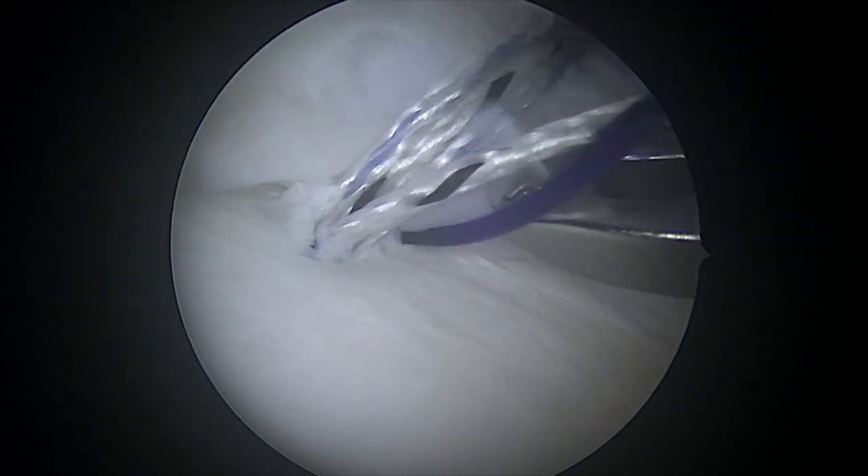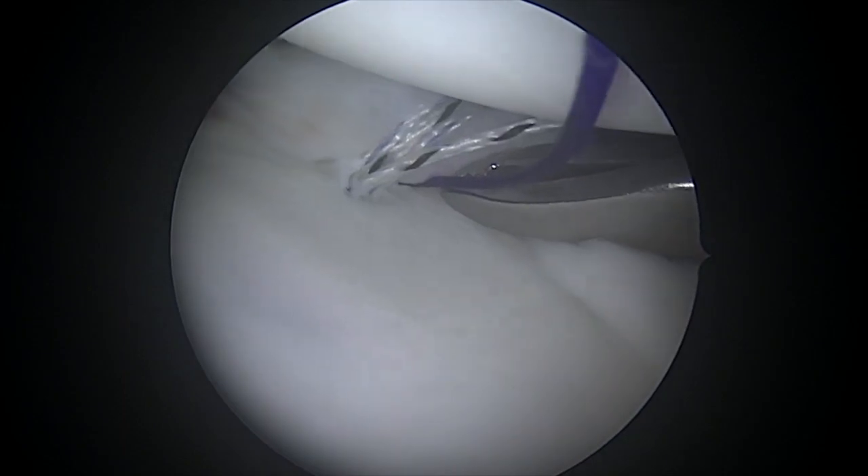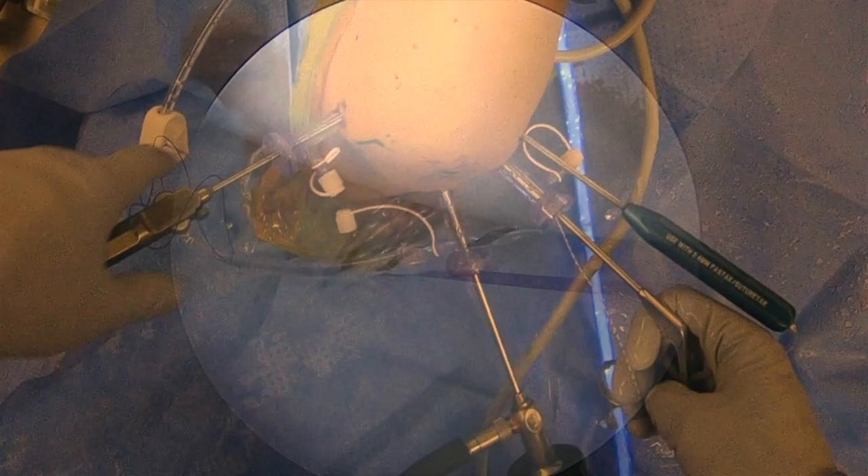I put anchors into the glenoid for this because I want to make sure it's really secure. Other people will just use the labrum as an anchor, and I have seen patients develop labral tears due to that, so we try to avoid that if we can.